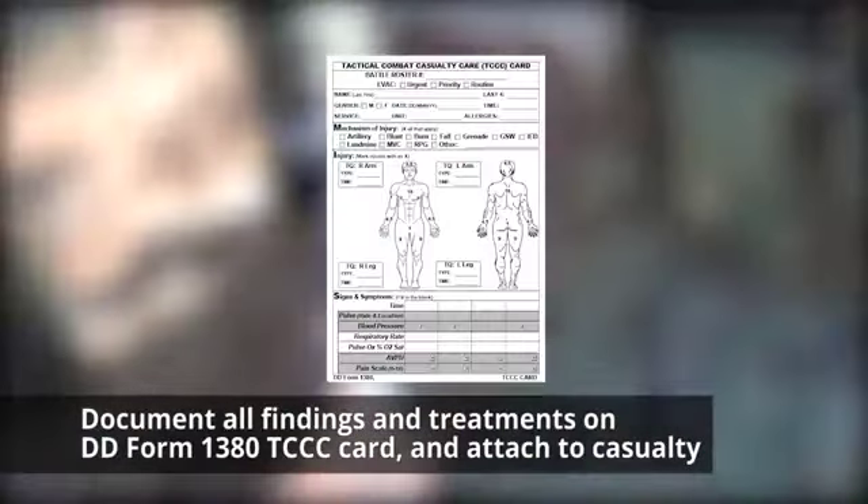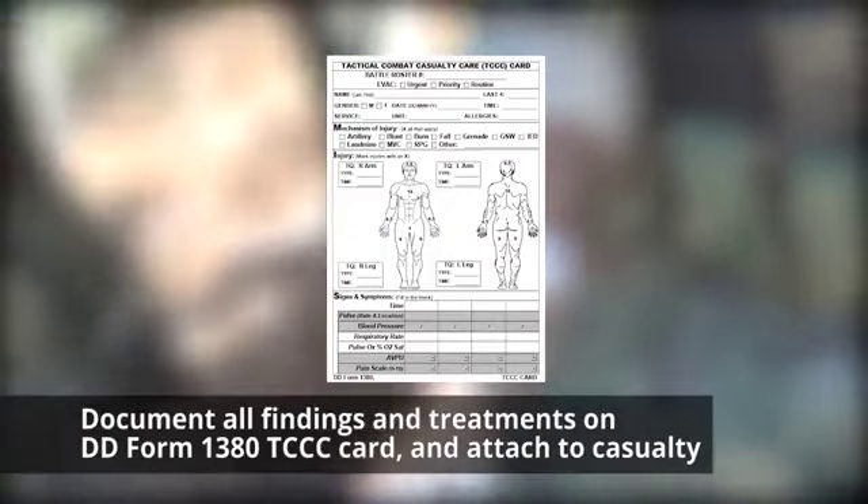Lastly, document all treatment on a DD Form 1380 TCCC Casualty Card and attach it to the casualty.